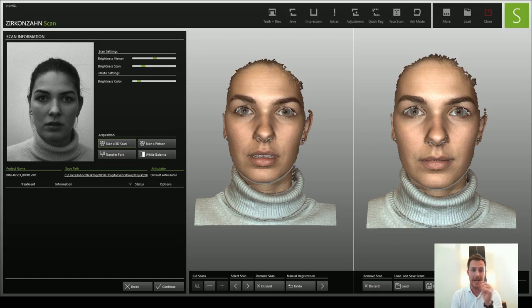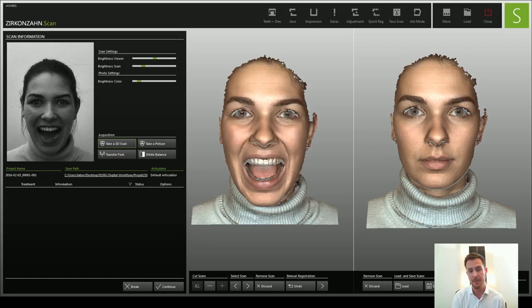in a relaxed lip position. This is very helpful for me when I have edentulous patients, for example, and I have to replace the anteriors, then I know exactly how long the incisors should be, because the upper ridge of the lower lip will help me to indicate the position. And it's a little bit overdone here with that photo. You can do that. In my opinion, it's not really necessary to have a wide open mouth, but you can do any kind of photos you want to or you need.